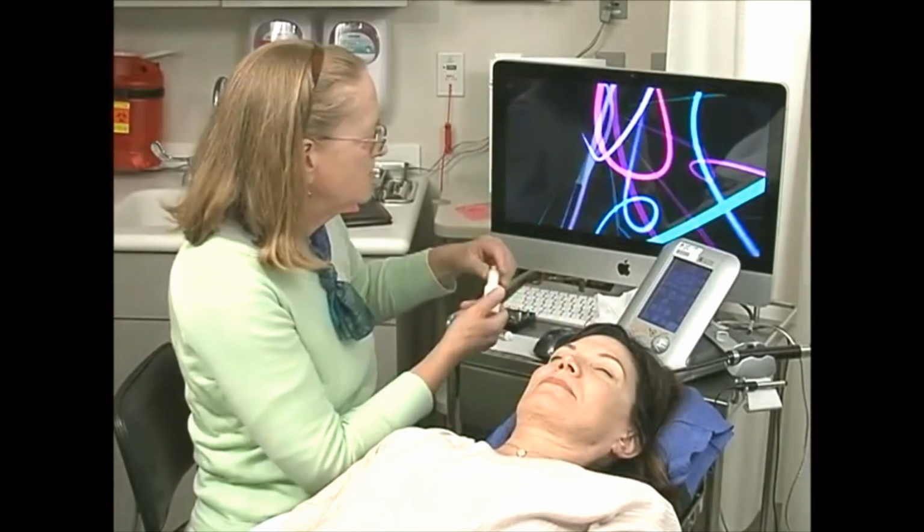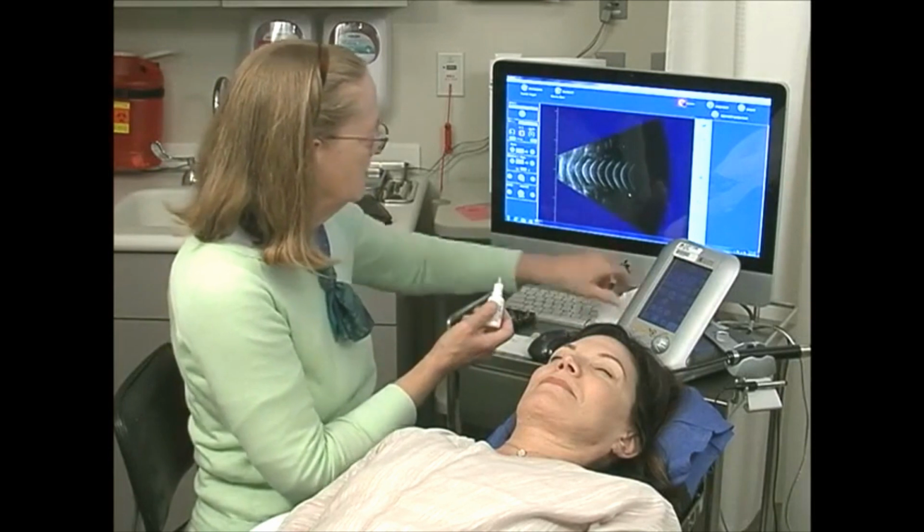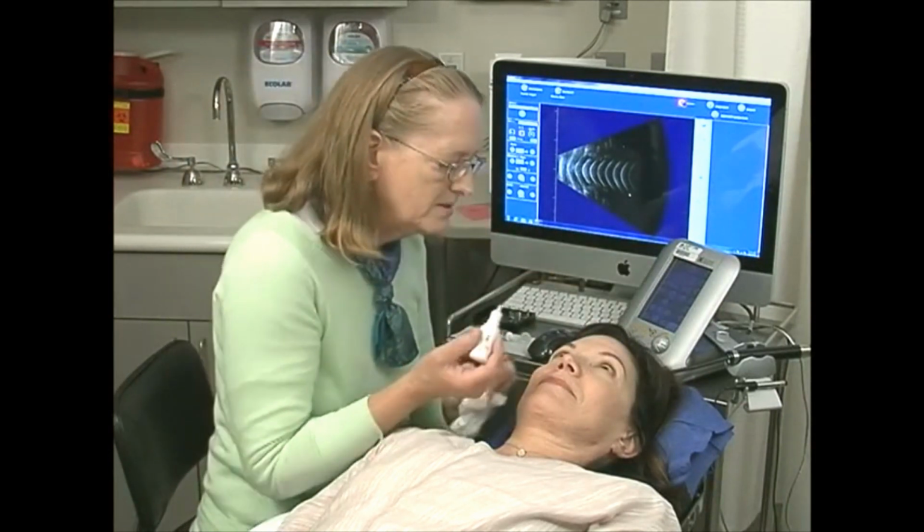We'll begin by instilling a drop of anesthesia. Would you look up, please?